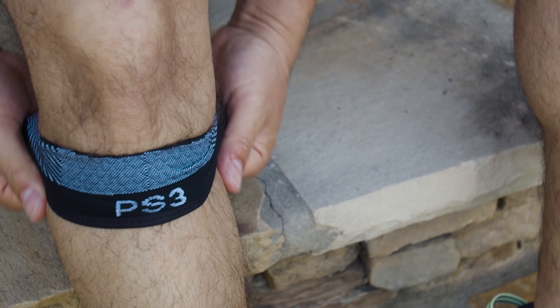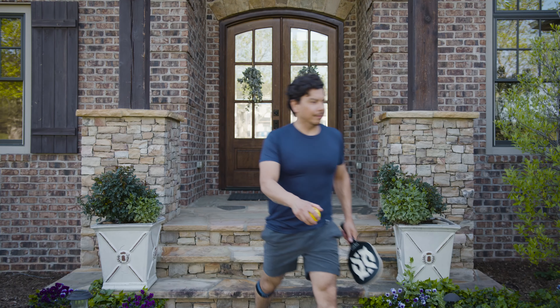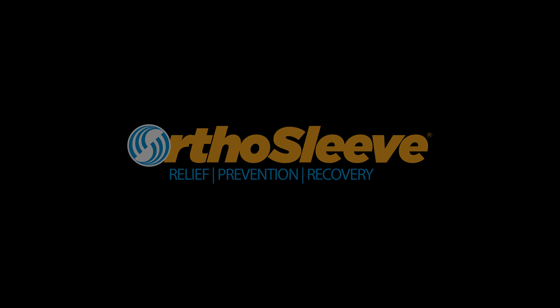As you adjust the sleeve, make sure the logo is sitting under the patella or kneecap. You should be able to maintain the full range of motion you had before. The gel grip will keep things in place as you move pain-free through the day.